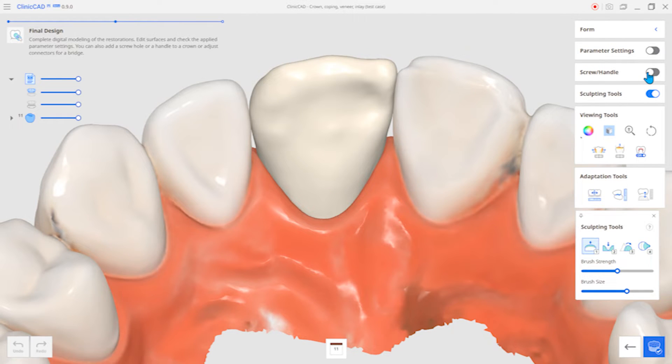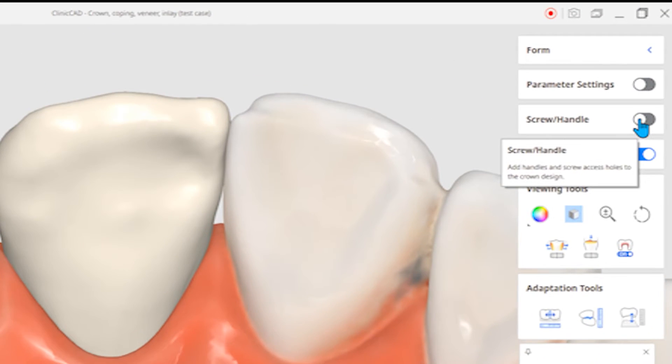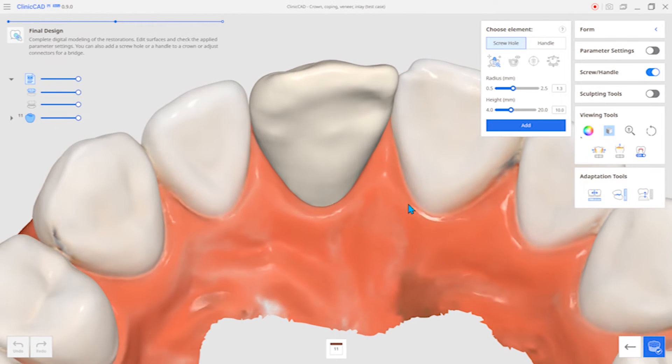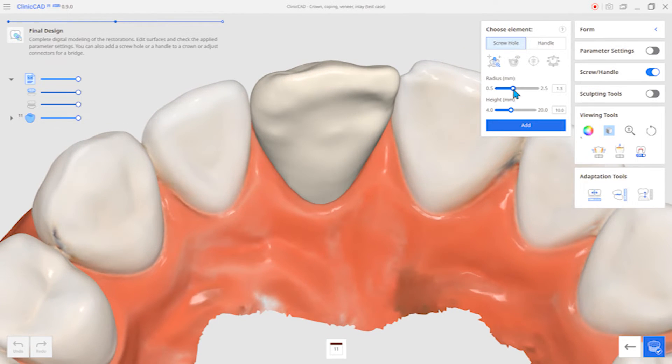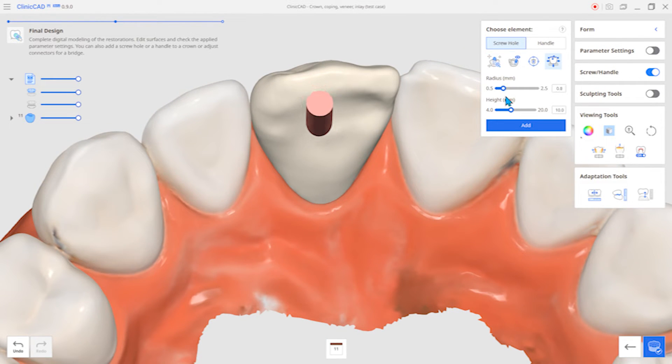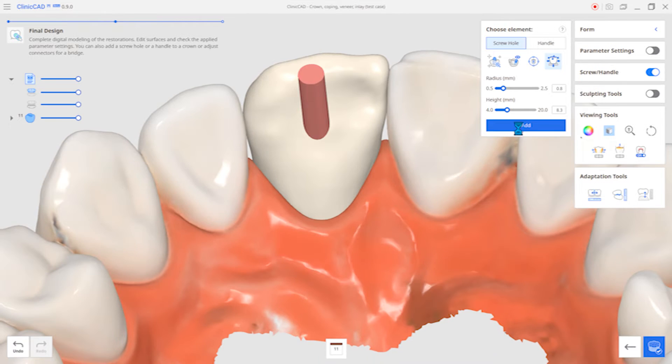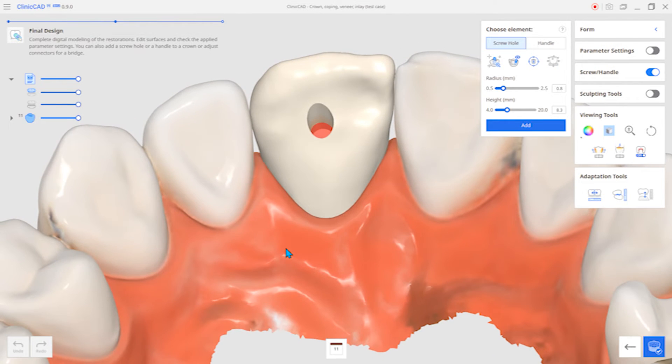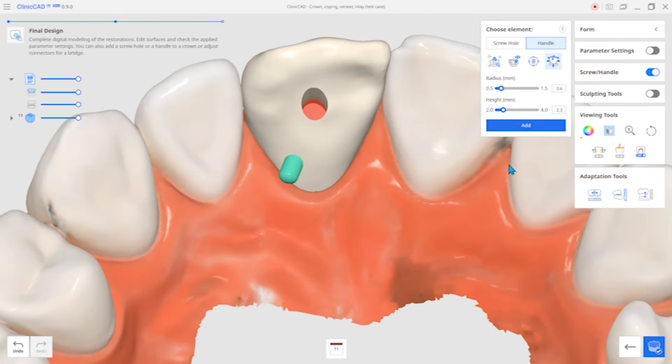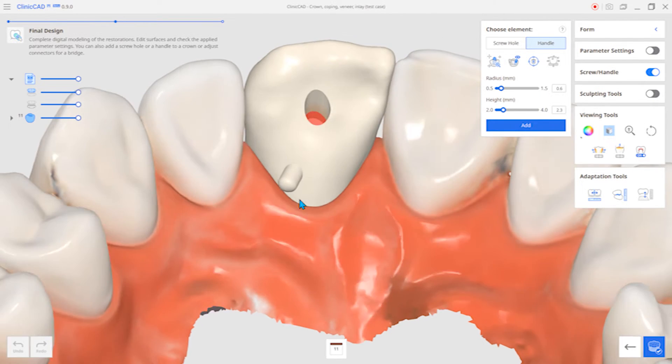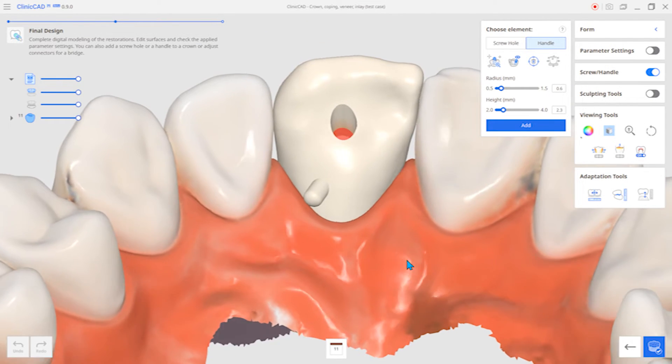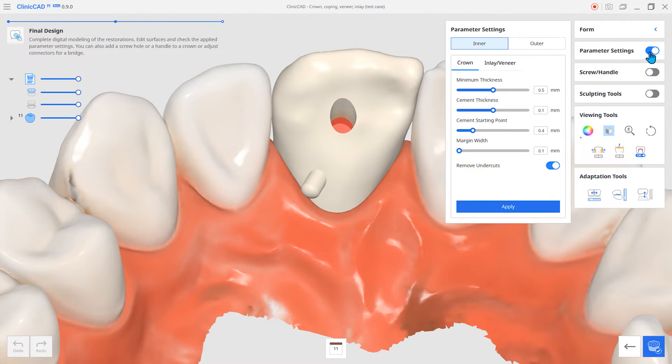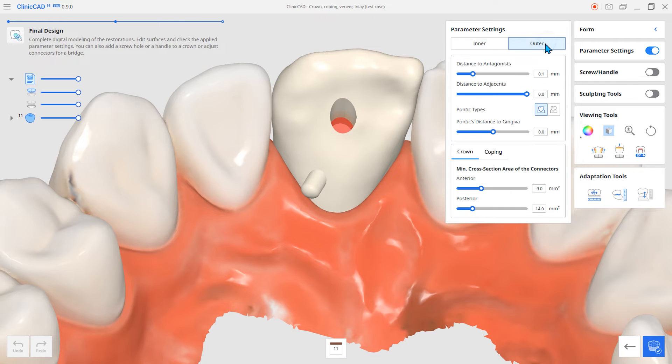The following feature is the Screw Hole Handle function. You can create holes or handles in the crown. In addition, you can set various internal and external parameters to have the best fit for the restoration.